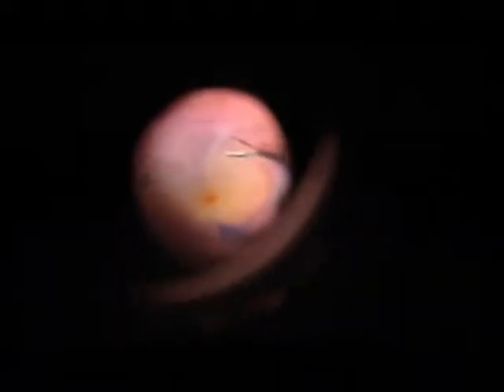You could peel with perfluorocarbon. This is a border case, I think, but it functions with perfluorocarbon. You could also question whether ILM peeling is necessary — because this is a VMTS, I want to be on the safe side.